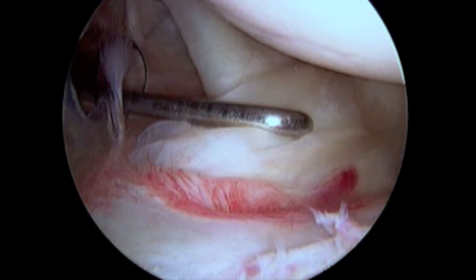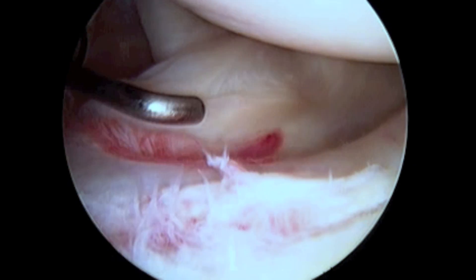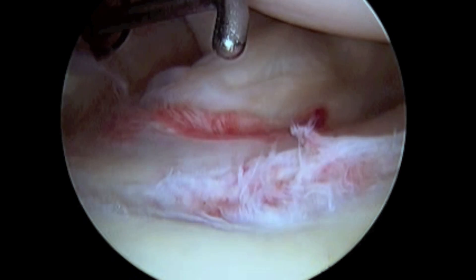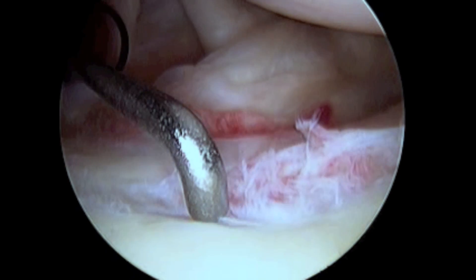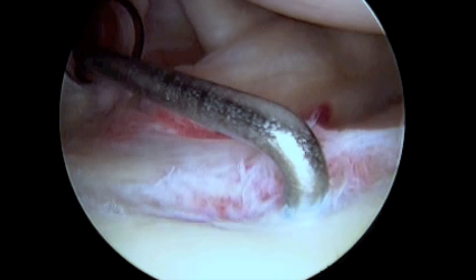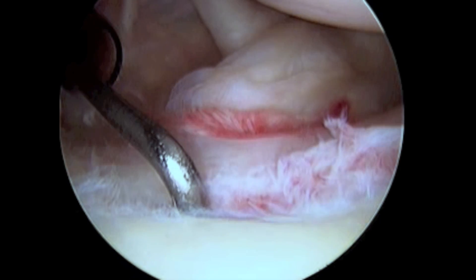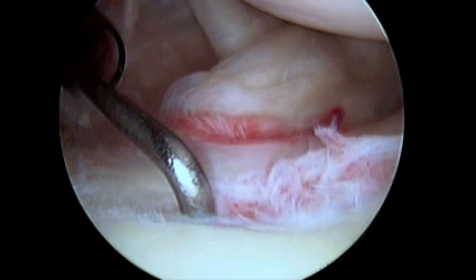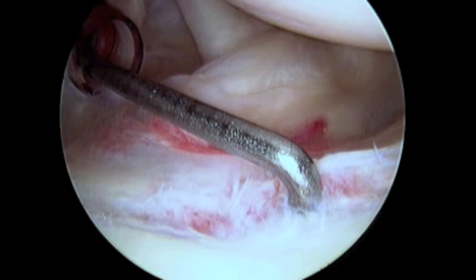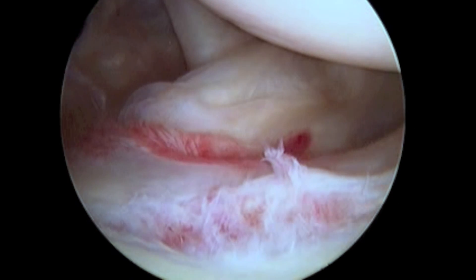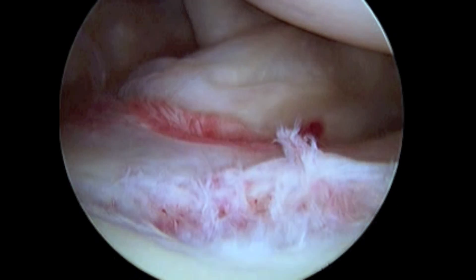The next structure probed is the anterior aspect of the labrum. The labrum is a fibrocartilaginous rim attached around the margin of the glenoid fossa. The labrum deepens the articular cavity and protects the edge of the glenoid rim. As you can see here, degenerative wear due to normal use is not an uncommon finding during arthroscopy.